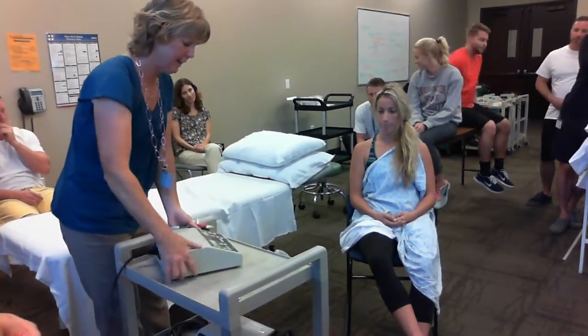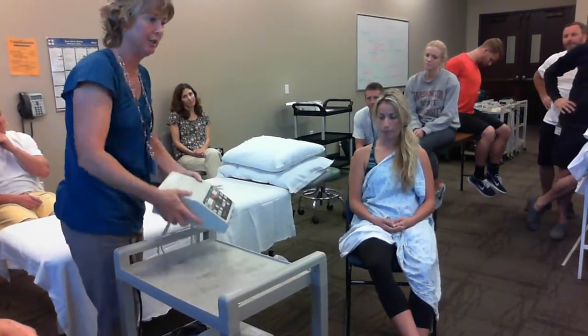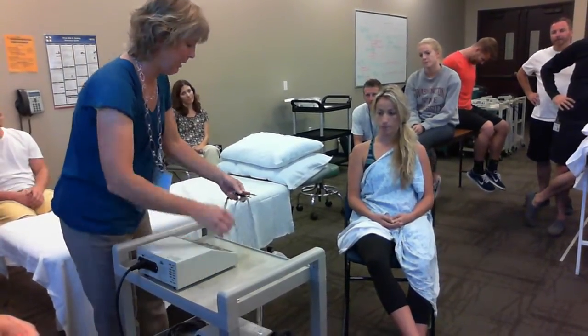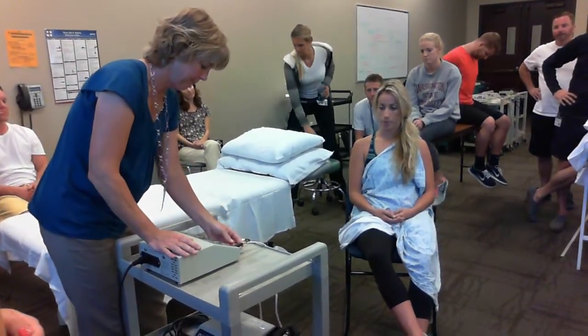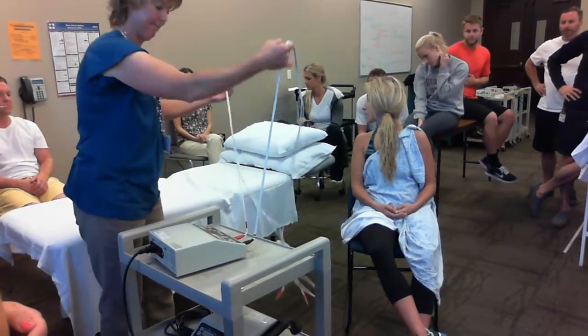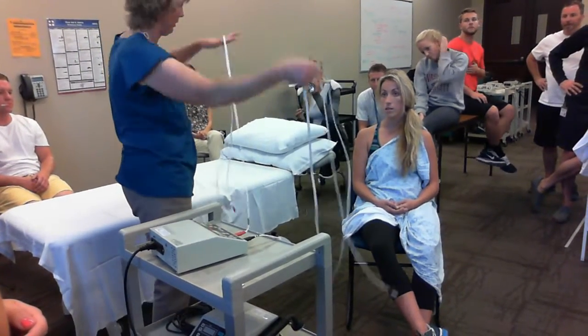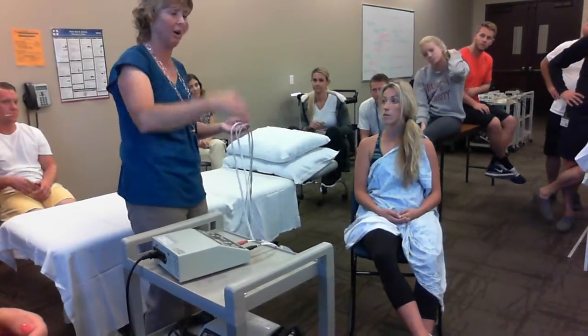So on the device, it will say channel 1, channel 2, high volts. Make sure you're plugged into the correct place. Doesn't matter, black or red. I'm just going to choose randomly here. And you can't have 2 reds and 2 blacks. Doesn't matter. And this one can be longer than the other one. Okay, that happens. You're going to see on all those machines, you'll say, oh, why is this one so long? It just is.